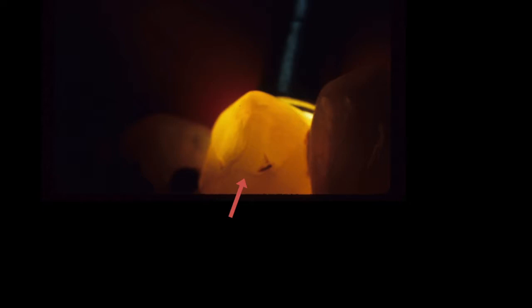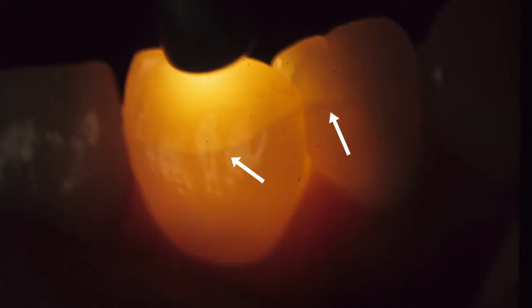During the preparation, this looked like it was cracked at the base of the cusp, but transillumination revealed that it was not. These are the typical enamel craze lines, which are not dangerous in any way. This is a very severe marginal ridge crack.